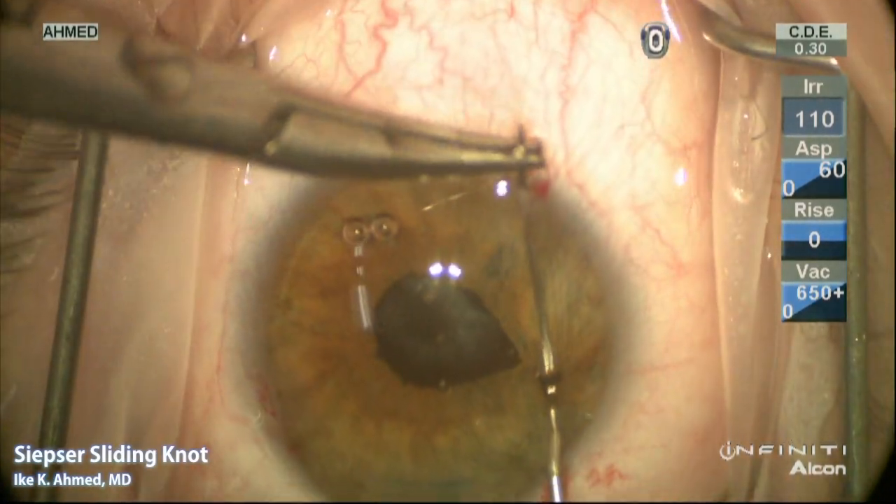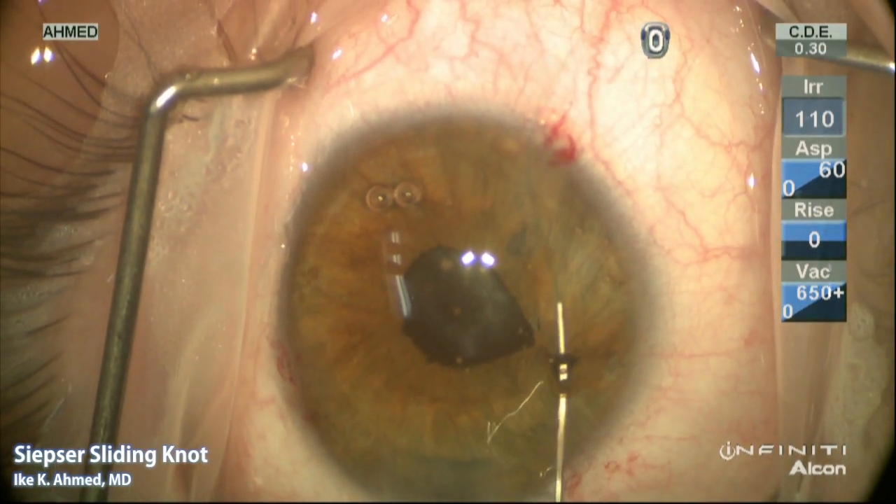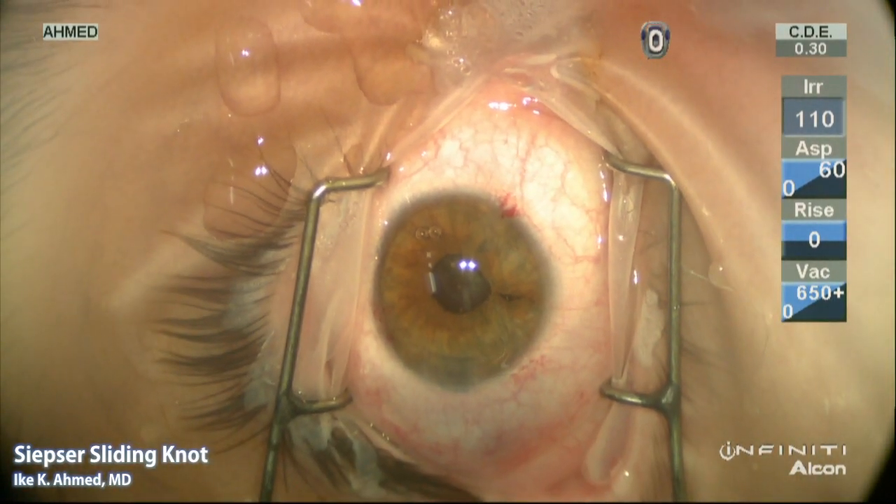The suture needle is withdrawn through the eye with the use of a 27 gauge cannula, which helps to prevent the needle from being trapped into the cornea. It's important to have two paracenteses through which the needles have been passed.